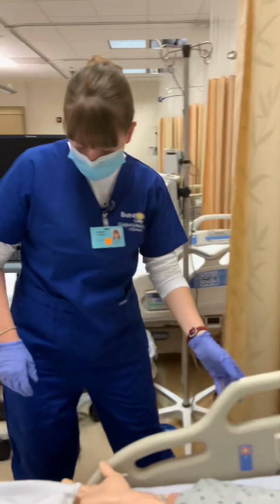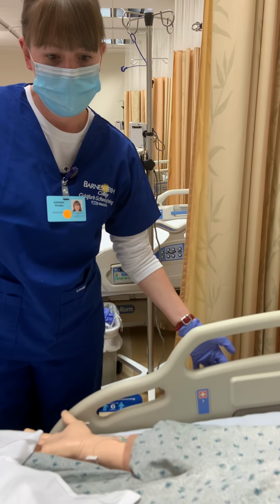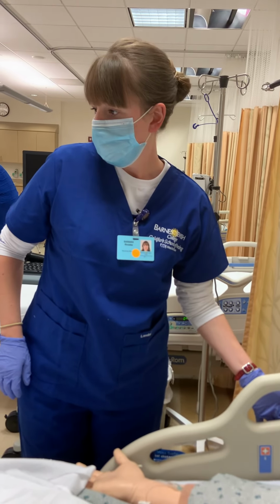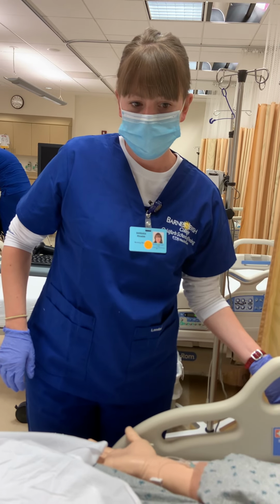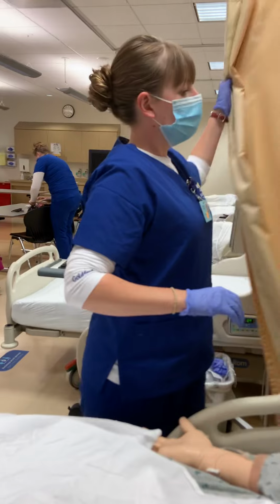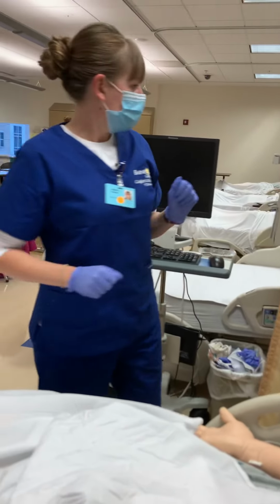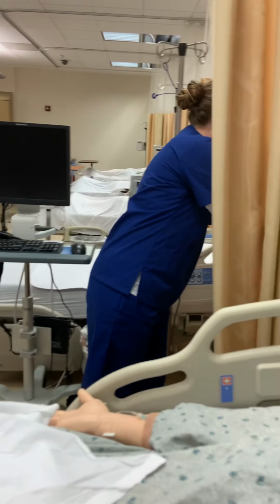Looks like your bed is locked. Let's move that up. Since there's someone next door, I'm going to pull these drapes to give you a little privacy. Let me just clean your bedside table.